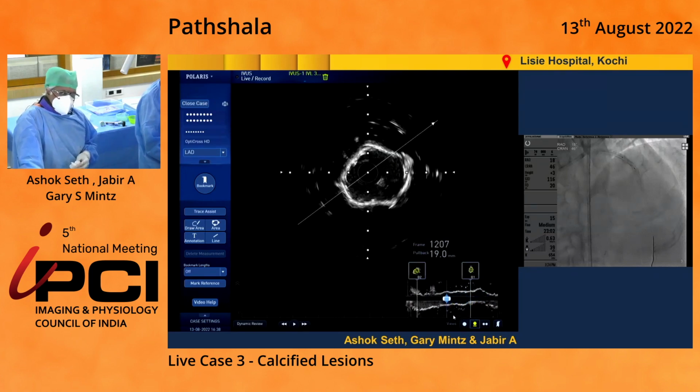But I'll be giving 10 seconds between each. If we need to deflate for any ischemia, etc., and this is probably not going to happen in this case, we can always deflate and then go up. But be patient with the OPN, and you don't need to just take it straight up to 35 and 40, because you let the lesion have the pressure and gradually expand.